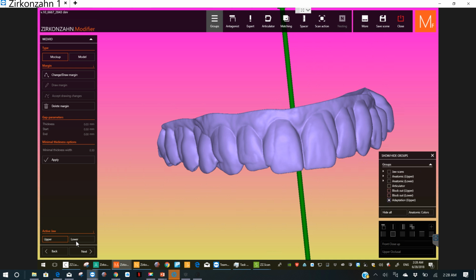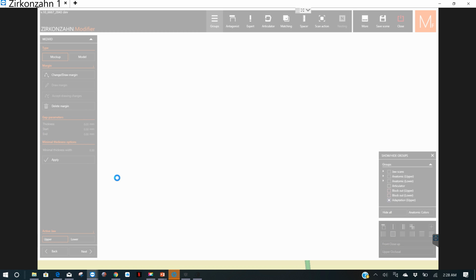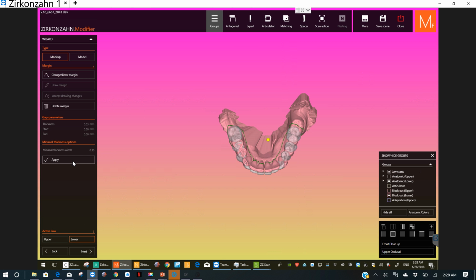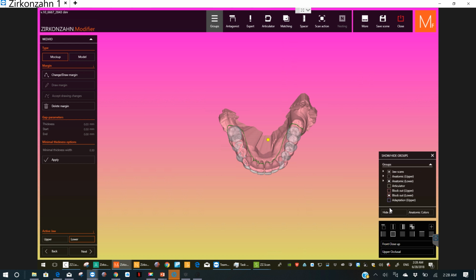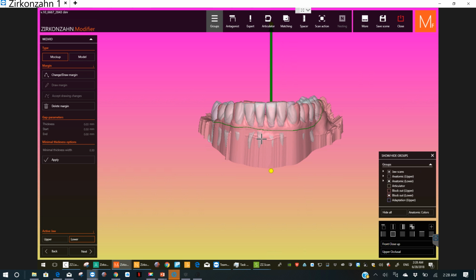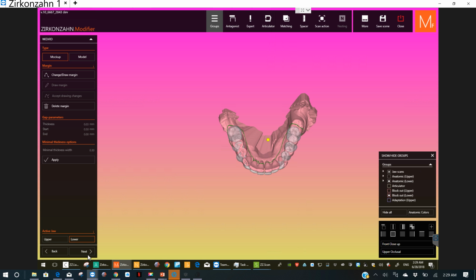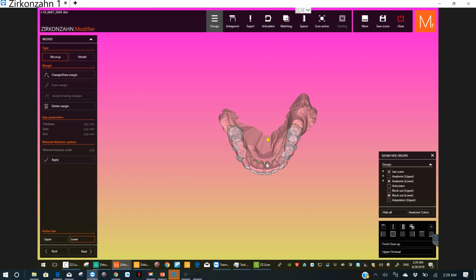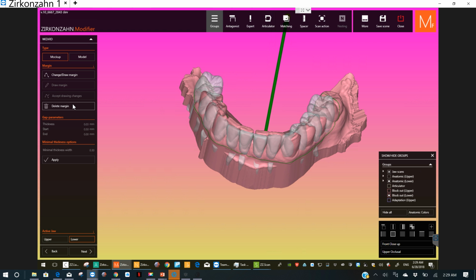And then same thing with the lower. I'll use that lower one. Let's apply it. I'm not sure what it's doing. Oh, next. Next. And it wants me to round the margin.